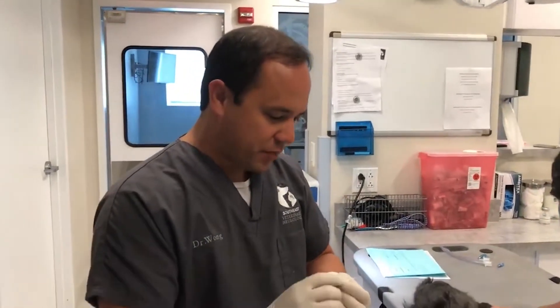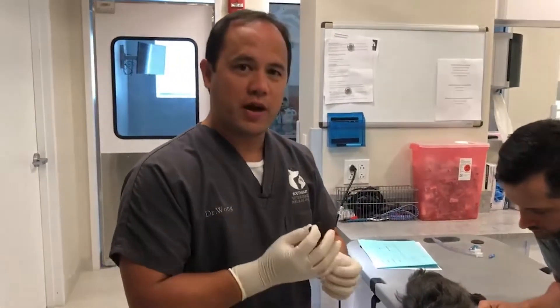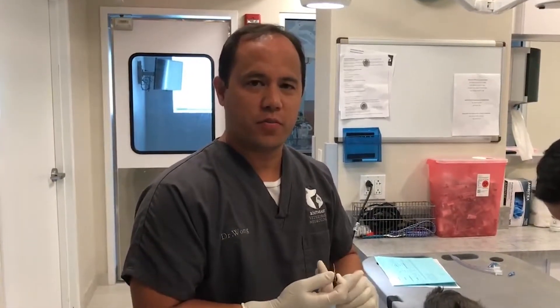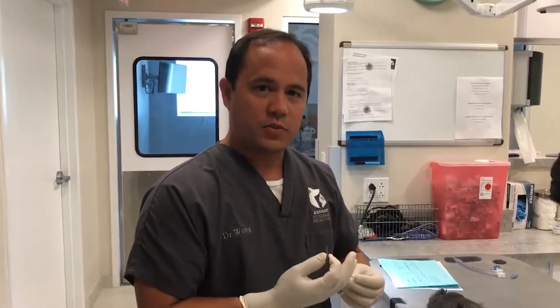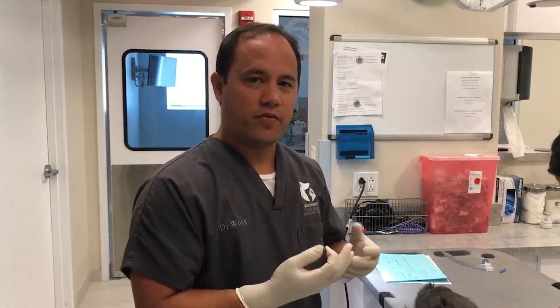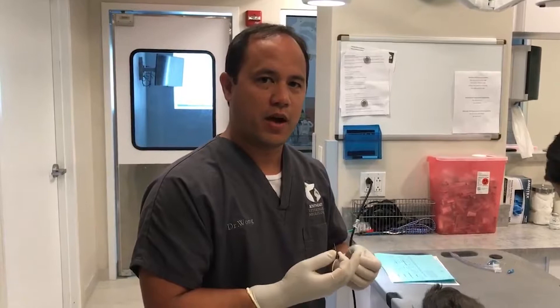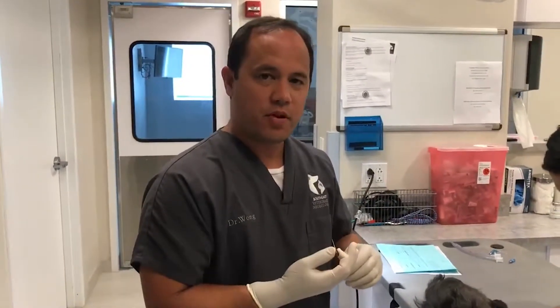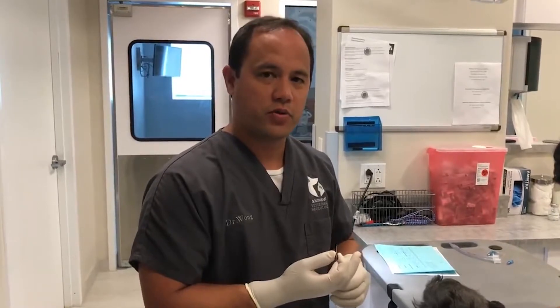We're going to be doing a spinal tap here on this pet. We do spinal taps to look for things like encephalitis — inflammation of the brain. What a spinal tap is, is a collection of cerebral spinal fluid. Cerebral spinal fluid surrounds the brain and spinal cord, and we use it to assess the number of cells, the type of cells, and the protein level.